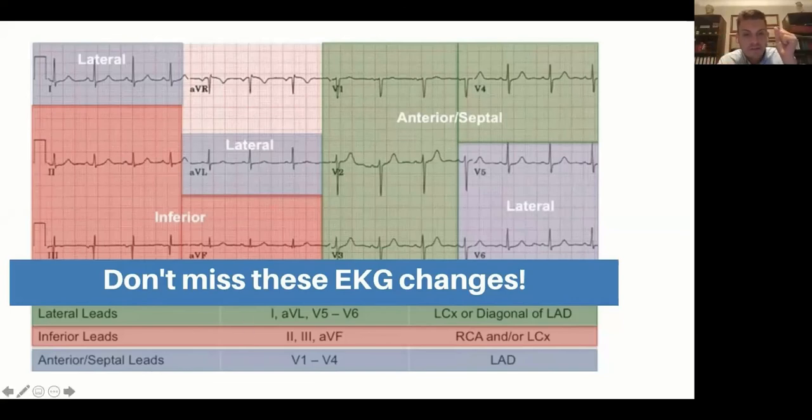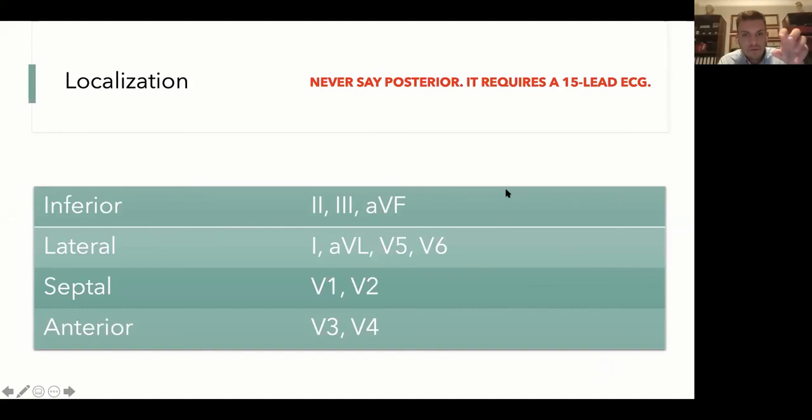Does anybody have any questions that they would like me to explain concerning this slide? Good. I beg of you, never say the word posterior on a 12-lead ECG. It's just plain wrong, okay?